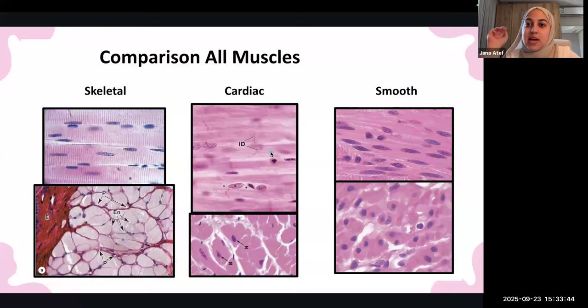Cardiac muscle, same thing. I want three features for cardiac muscles. Intercalated discs, branching, yes. Exactly, and one to two nuclei. That's it. So we look at it, it's branching. You see this one is moving into the next one, it's like all of them are connected to each other and have intercalated discs, okay? What was the function of intercalated discs? Why is it there?